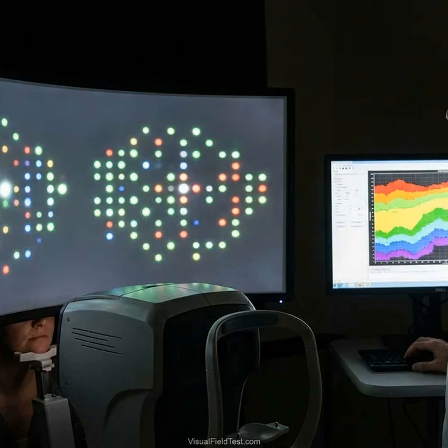Mapping functional loss to structure, OCT angio. Structural OCT imaging of the retina and optic nerve has revolutionized glaucoma care. Retinal nerve fiber layer, RNFL, thickness, and the ganglion cell complex, GCC, in the macula, ganglion cell plus inner plexiform layers, are closely linked to functional loss.